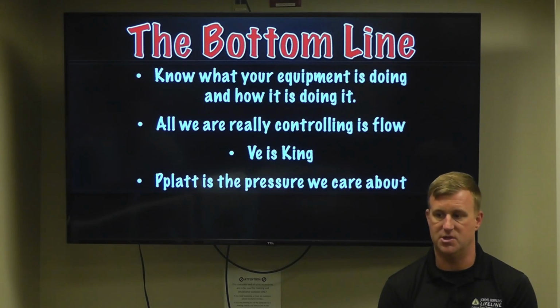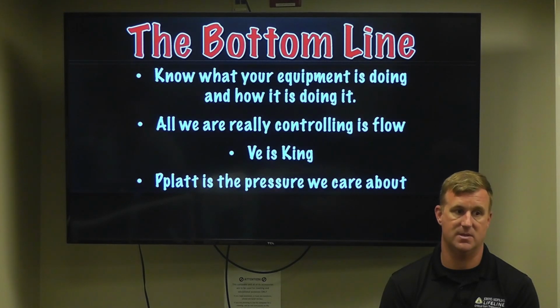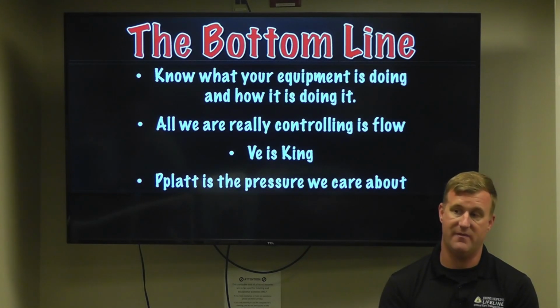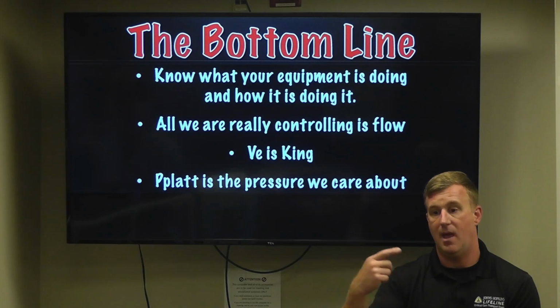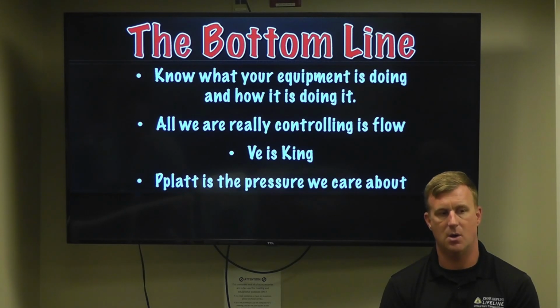In fact, we've had a couple situations with the T1 where we haven't been able to ventilate the patient because they're that sick from a status asthmaticus standpoint that we can't give them enough pressure. We have to go back to the LTV or an ICU ventilator that will push a higher pressure and allow that to be delivered, or a volume ventilation, because the T1 and the C1s won't deliver a volume ventilation. So understanding your equipment is key.